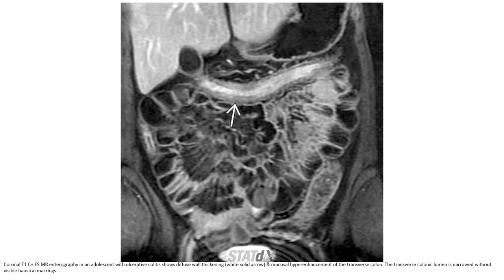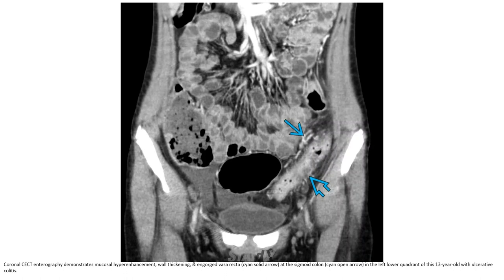T1C+ fat-saturated MRI enterography in an adolescent with ulcerative colitis shows diffuse wall thickening and mucosal hyperenhancement of the transverse colon. The transverse colonic lumen is narrow without visible haustral markings. Contrast CT enterography demonstrates mucosal hyperenhancement, wall thickening, and engorged vasa recta at the sigmoid colon in a 13-year-old with ulcerative colitis.